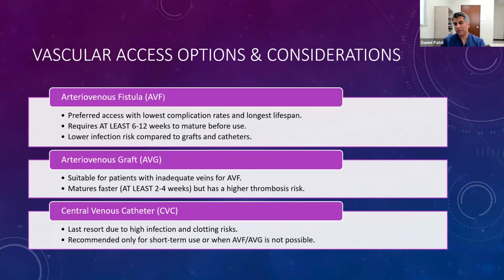And then with catheters, there are some patients that just rely on a catheter. Patients with significant low blood pressures that are on midodrine that can continue to clot their accesses. Some of them need catheters. Others have exhausted accesses, and catheters are the best options. And not every catheter is going to have sepsis and death. We have some patients that go many years and, don't tell them, but there's some patients that have many years without problems with the catheter.